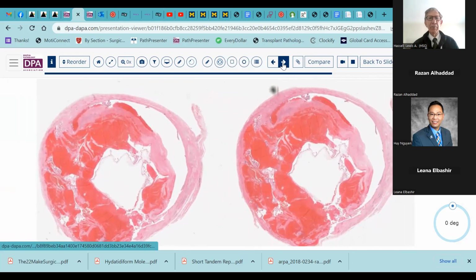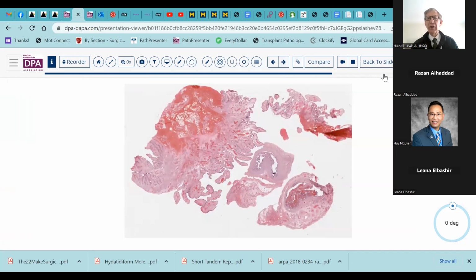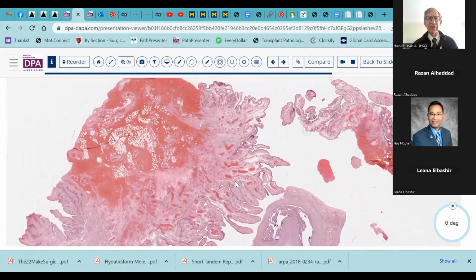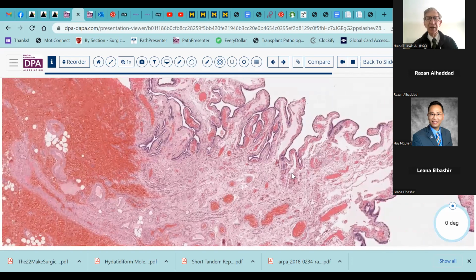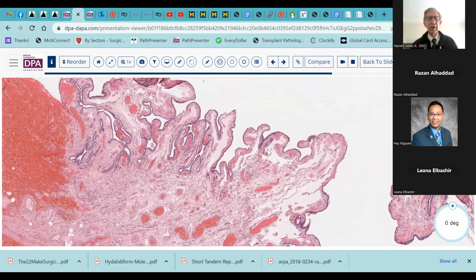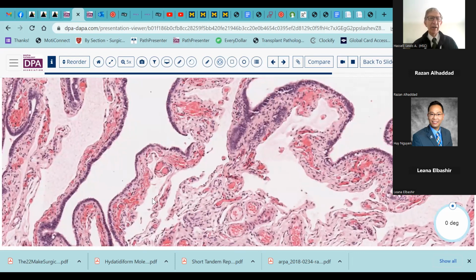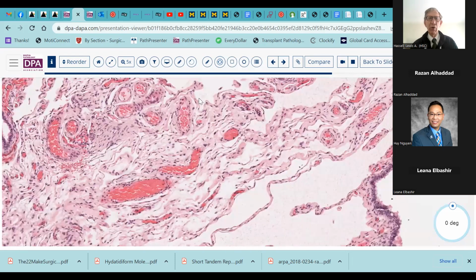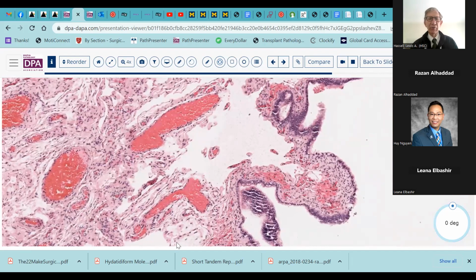Okay, so we've covered some non-neoplastic things. Let's take a look or two here and see where we come in terms of beginning to evaluate things for possible neoplasia. One of the more frequent things that we see these days is the question of somebody who has a family history or has been identified as a BRCA2 or BRCA1 carrier. And so we're asked to do the full evaluation to look for evidence of serous tubal neoplasia.